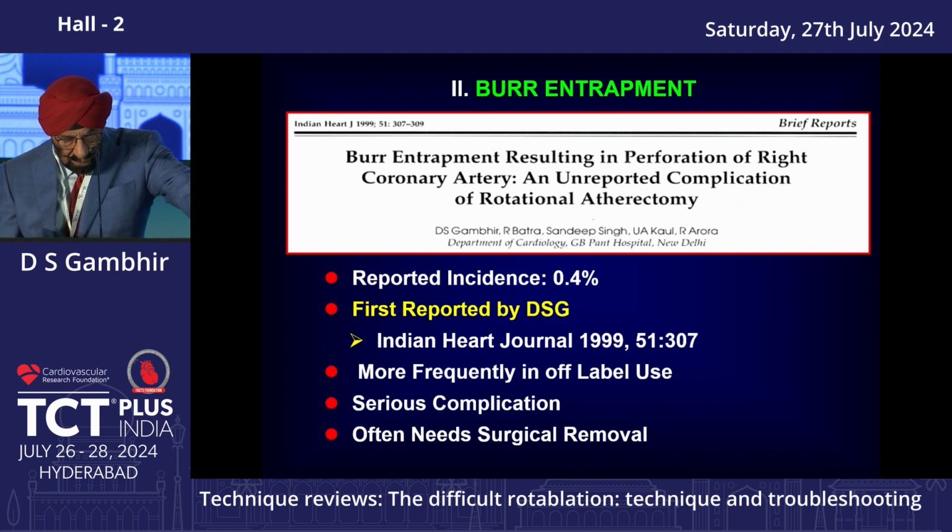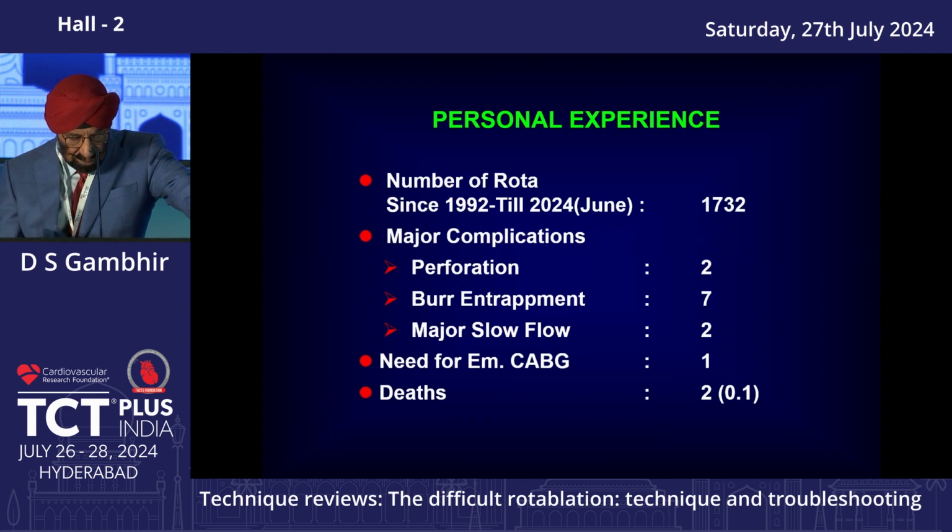Now, lastly, burr entrapment resulting in perforation of the right coronary artery was first reported by me way back in 1999. Till then, no case had been reported. Of course, now about 15 odd cases have been reported. So this is my experience of rota till June 24, 1732 cases. We had perforation only in 2 cases, burr entrapment in 7, out of which serious entrapment took place only in 1 case, which I reported, where the perforation took place but the patient was saved. Major slow flow in 2, need for emergency surgery in 1, and deaths occurred in 2 patients.